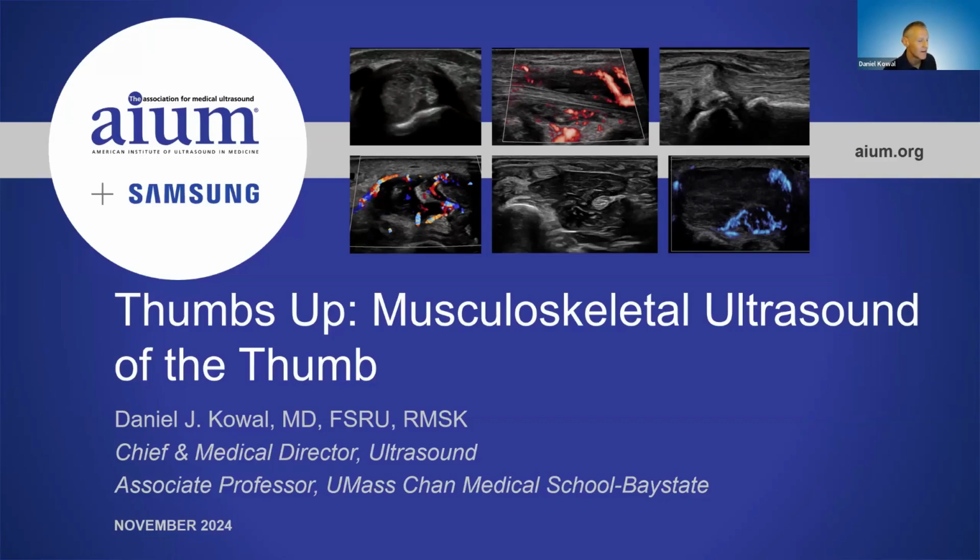Someone asked if they could use a 12 megahertz transducer. That would be a bit of a challenge. You could definitely use it for tendon evaluation. It would be harder to see some of the pulleys and the retinacula, but you could get it done.